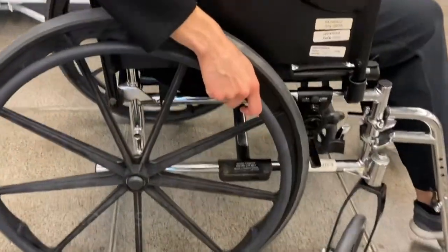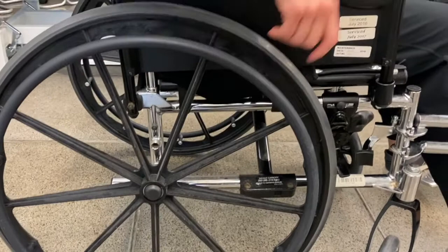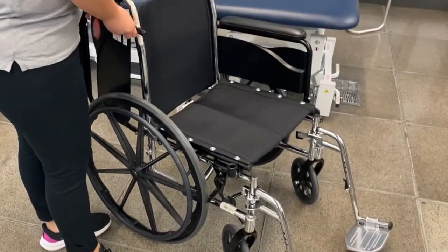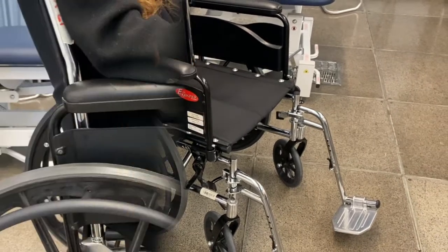The hand rims of the wheelchair are always in full contact with the patient's hands, which can be a source of infection. The armrests are also in full contact with the patient's arm and should be disinfected. Healthcare providers may also touch the armrest to remove and attach it back to the wheelchair.